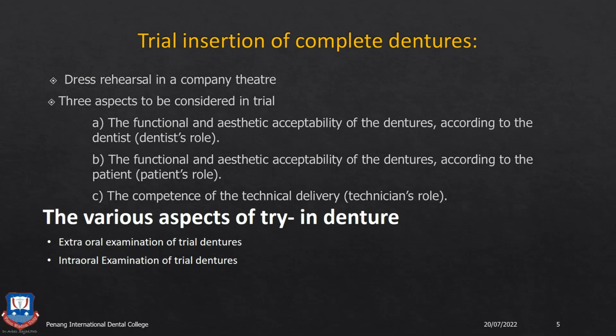So speech is one of the very important reasons for which many patients come to you to seek the complete denture treatment. So it is very vital that your teeth arrangement or the teeth setup does not impede the patient's pronunciation.